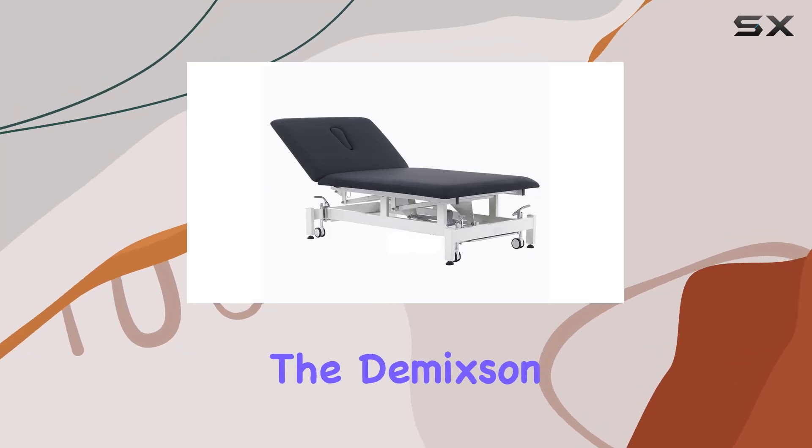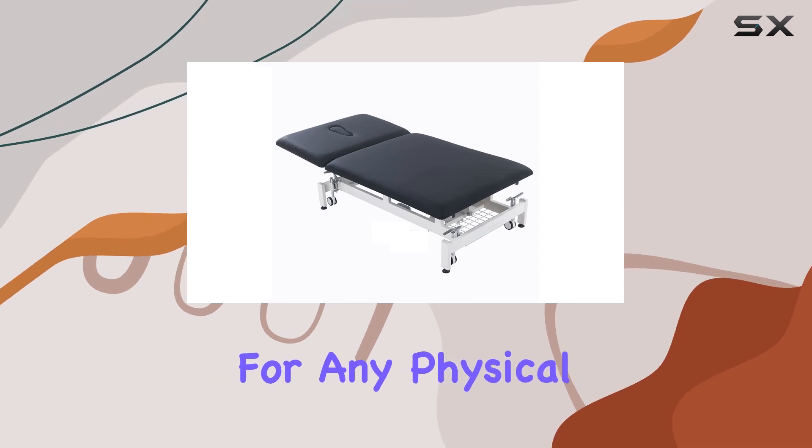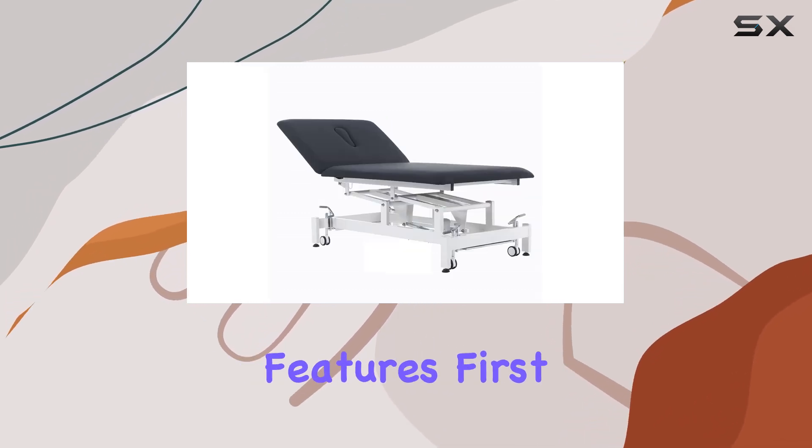Today, we're delving into the Demixson Homelyd High Low Bobath Table, an essential piece of equipment for any physical therapy setting. Let's start with its impressive features.